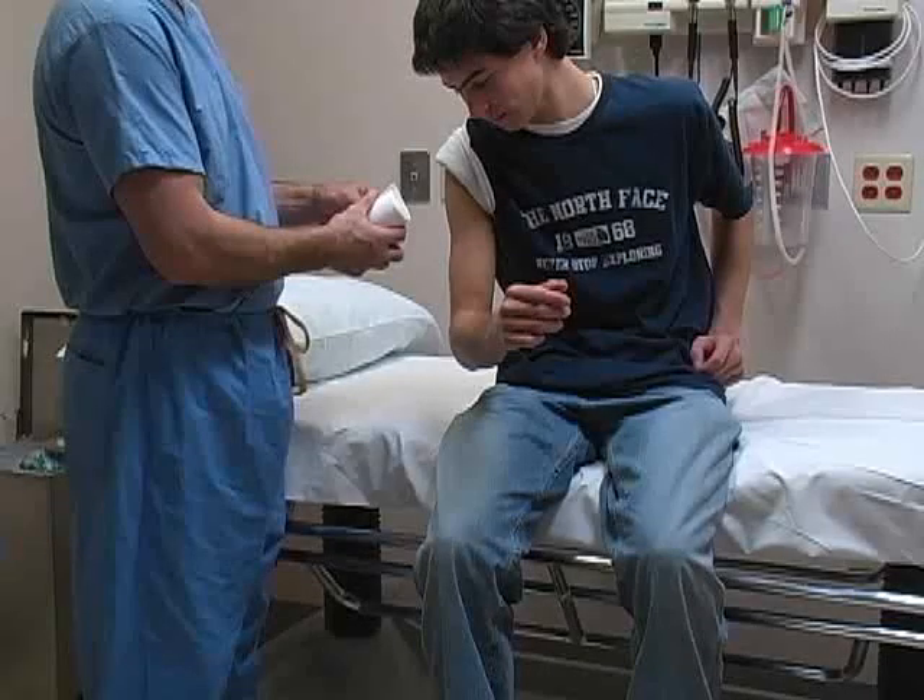Position the patient in a sitting position on the bed, with the arm held in neutral abduction and the elbow in 90 degrees of flexion.